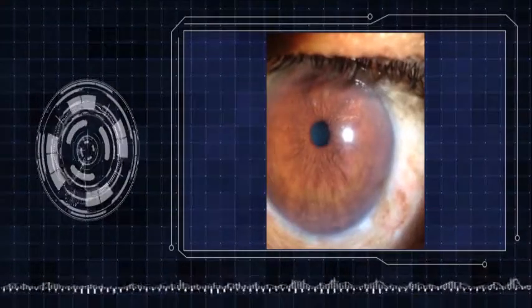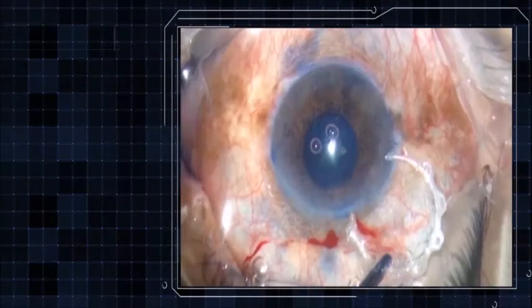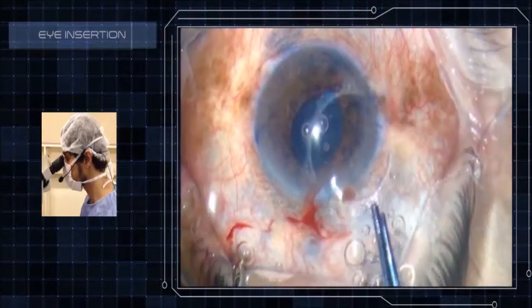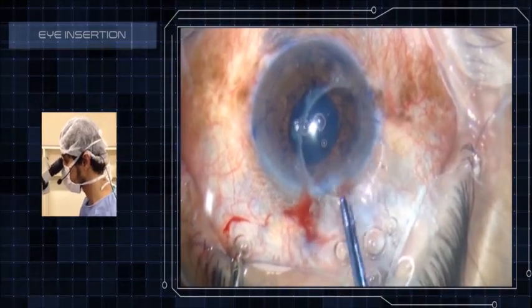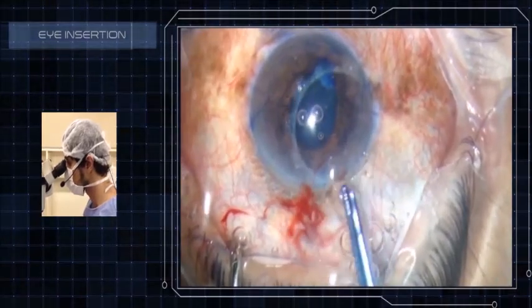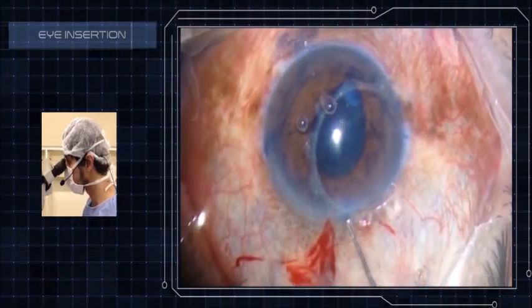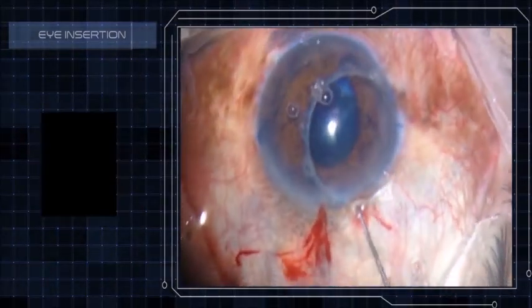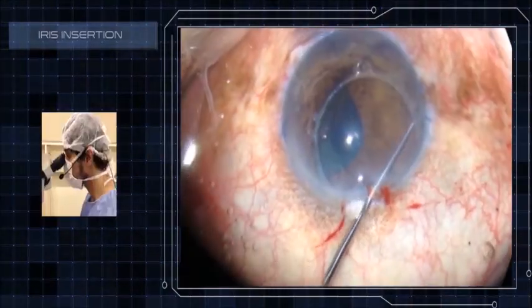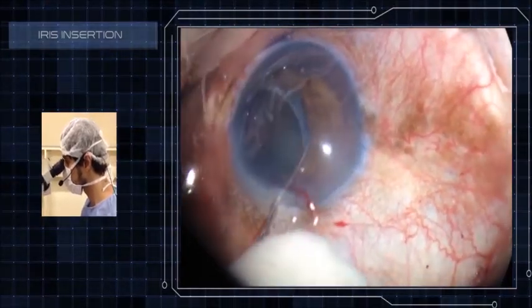See the real patient eye! Jarvis, can you hear me? I'm starting the surgery now. Take a look — it is really easy to insert in the eye. I'm using a Sinski hook and McPherson forceps, inserting the Sinski hook in the ring's groove and inserting one part at a time.